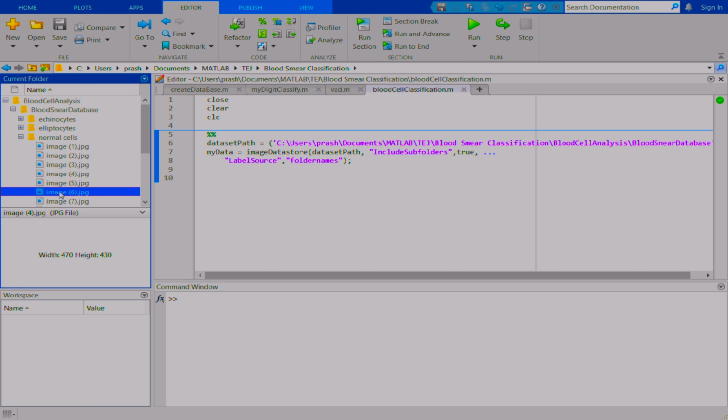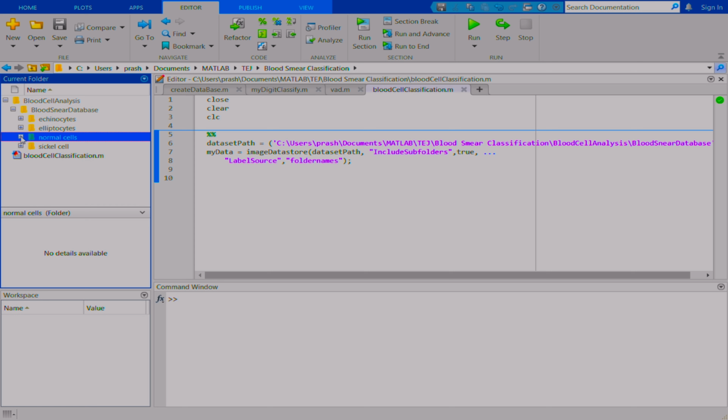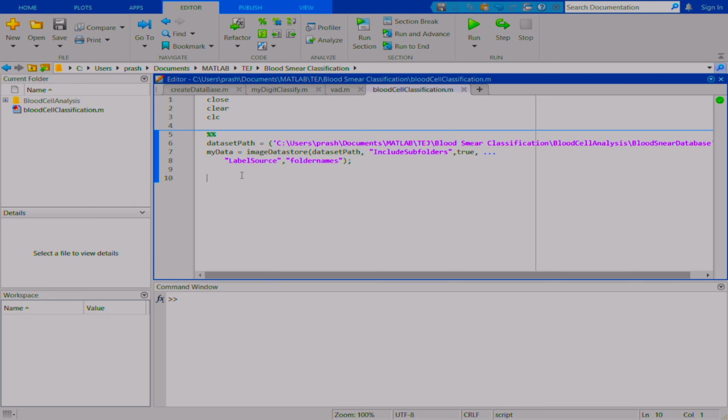So in every class the data has a variety of sizes, right? But if you try to give different sizes every time, it becomes difficult for any machine to adapt to those changes instantaneously.